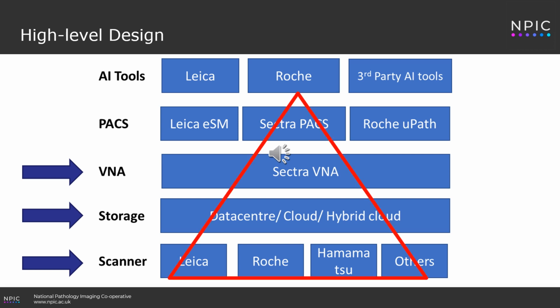I'm just highlighting the core elements of the overall solution: the scanners, the storage, and the Sectra PACS system.